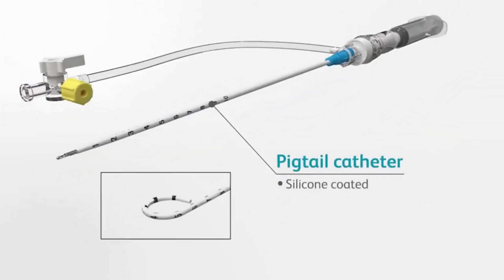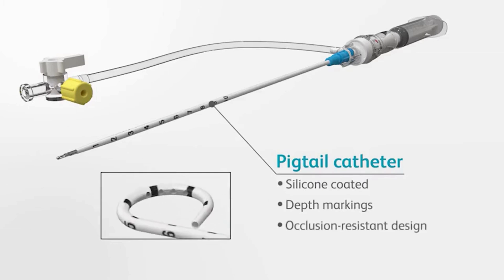The pigtail catheter is silicone coated for smooth insertion and reduced tissue trauma. Centimeter depth markings on the catheter shaft help achieve accurate catheter placement. Four strategically placed drainage holes on the inner pigtail help prevent occlusions.